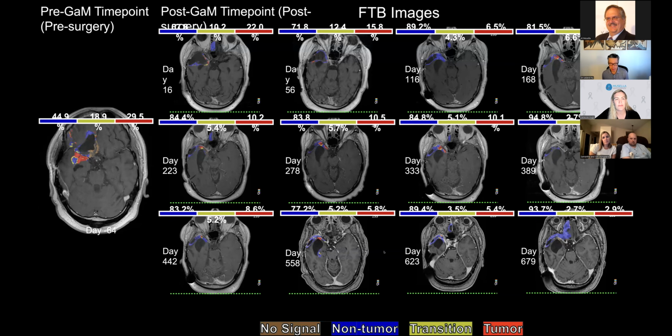From clinical experience, in areas where we do see recurrence, the presence of tumor even after giving Avastin, a lot of that tumor is non-enhancing. In general, they still tend to show elevated RCBV. So from an anecdotal standpoint, we still use perfusion. It may not be in the direct quantification context of FTB, but in general, we still recommend obtaining DSC perfusion even in the setting of Avastin.